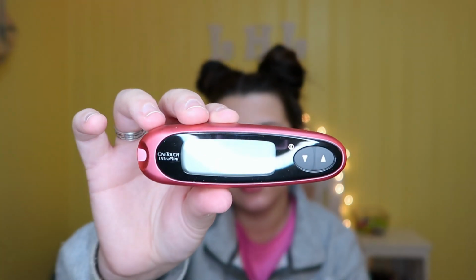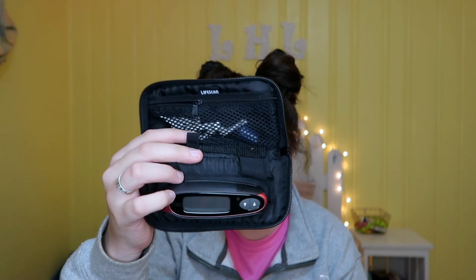It was just this really, really long meter. Took the same strips, I believe, as the One Touch meter that came with my first pump. But yeah, I loved this meter. I thought it was super cute, super sleek. I really liked the case. I actually really liked all of the One Touch meter cases because they had little hard plastic spots for the meter itself, which I thought was really handy.